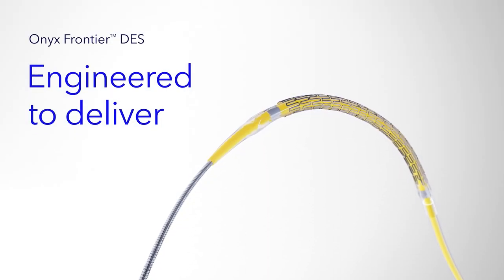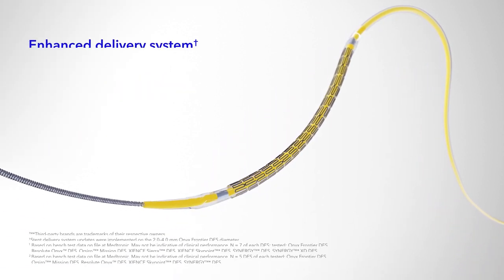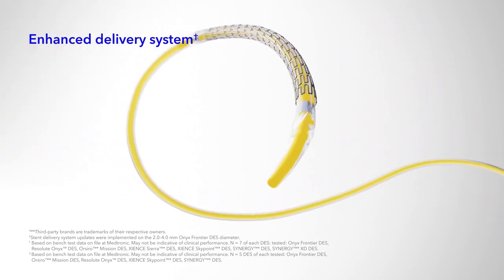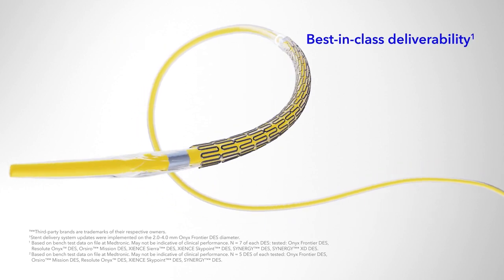Onyx Frontier DES — engineered to deliver. Onyx Frontier DES introduces an enhanced delivery system designed to take the acute performance of Resolute Onyx DES even further, providing best-in-class deliverability with a lower crossing profile.